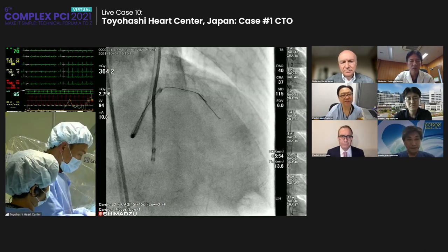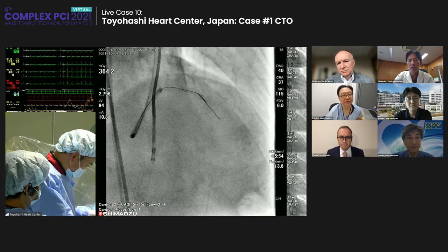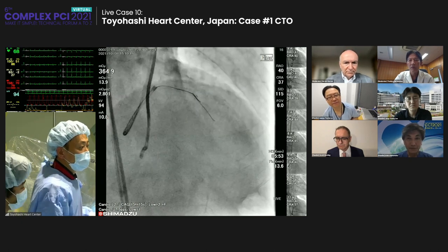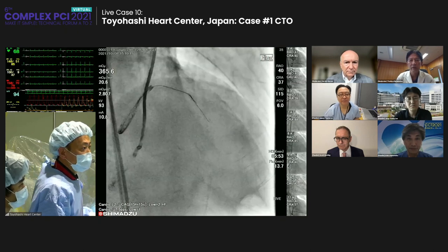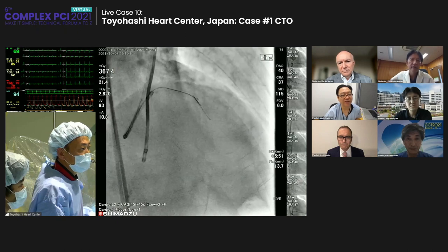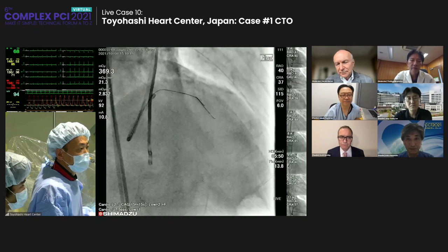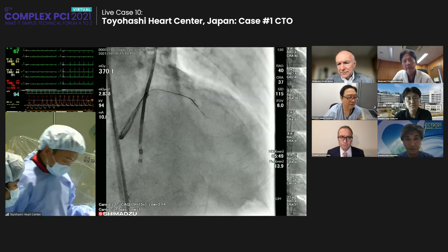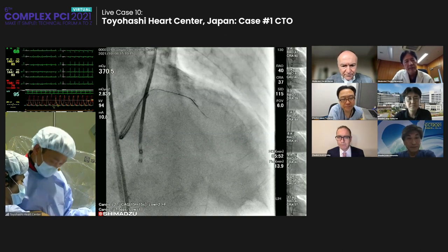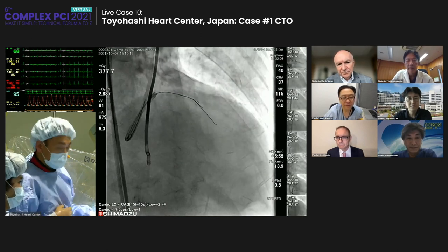I think if you're going to pass the balloon, I would usually do some sort of clear stent or stent boost before I inflate the balloon. Because if you are through one stent strut, then the balloon, even in a small balloon crossing, may deform the stent with the balloon inflation. So that's a nice check. So now it's a 1.5 balloon, it's a little bit distal. So I want to dilate it here.